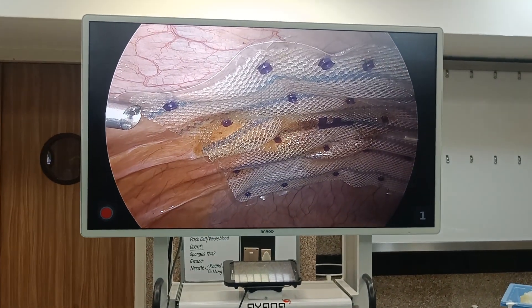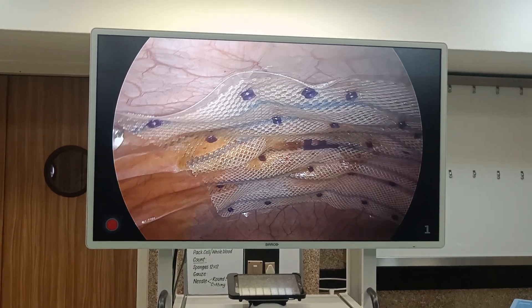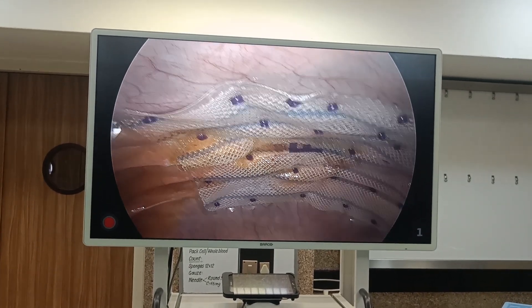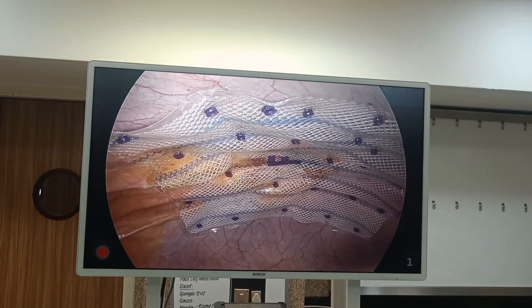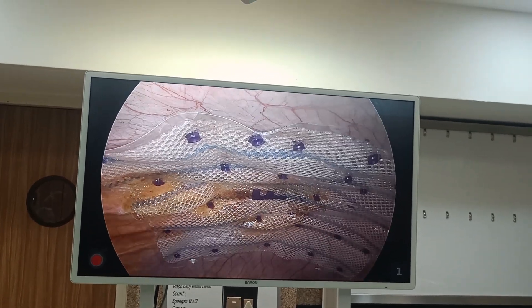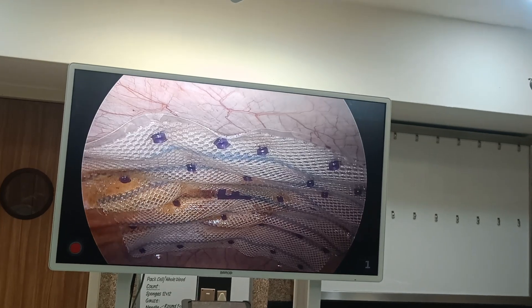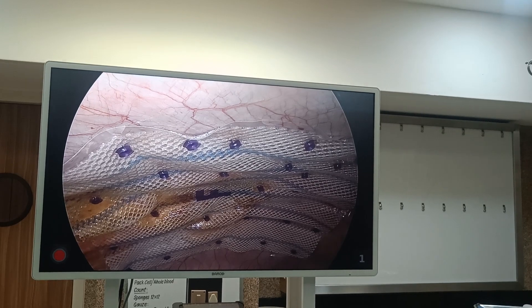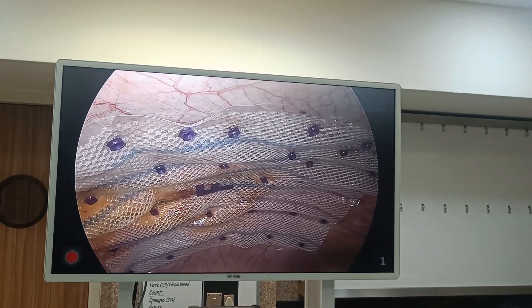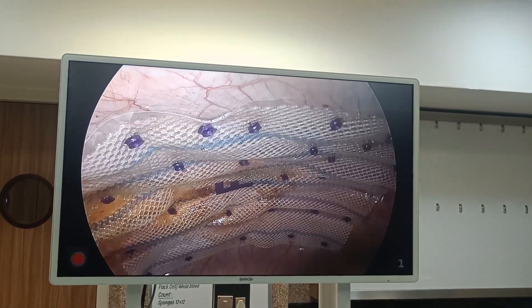There are other methods we routinely use — that is eTEP, Rives-Stoppa repair, and there is one method where we create a peritoneal flap, which is a very new and cumbersome technique, but where there is no need to put this type of dual-tissue separating mesh — you just put the prolene mesh.